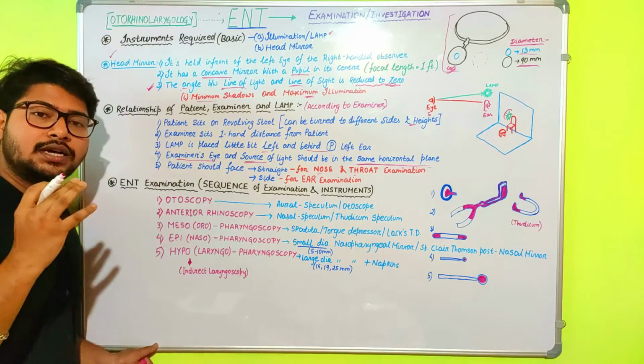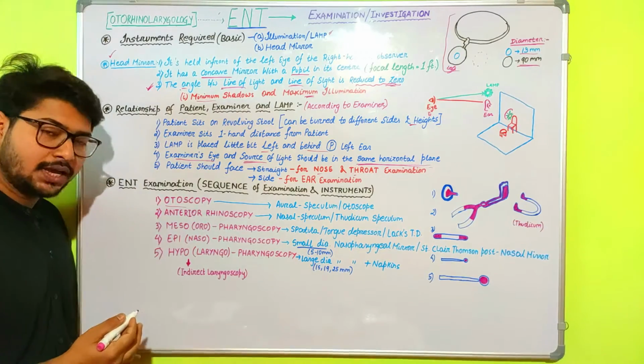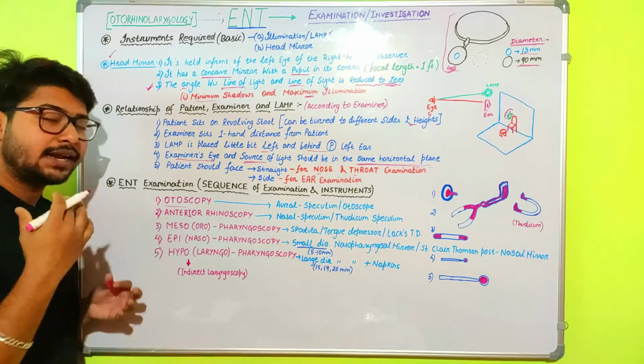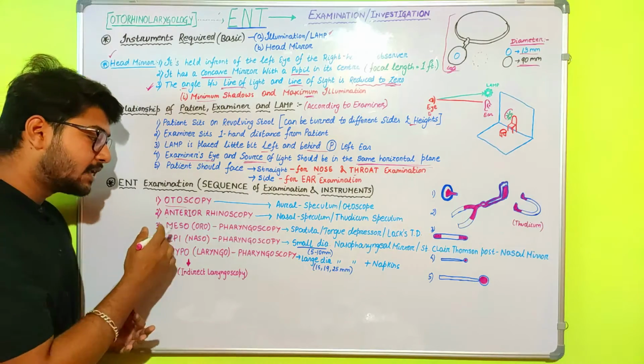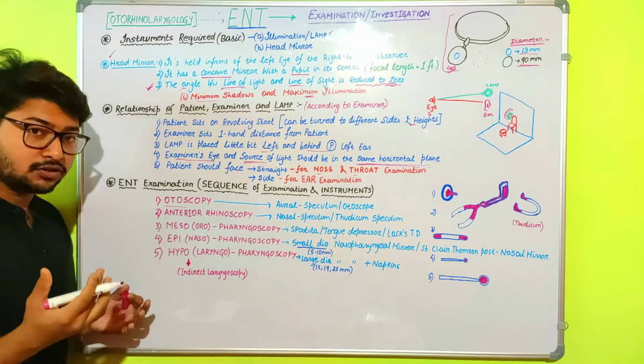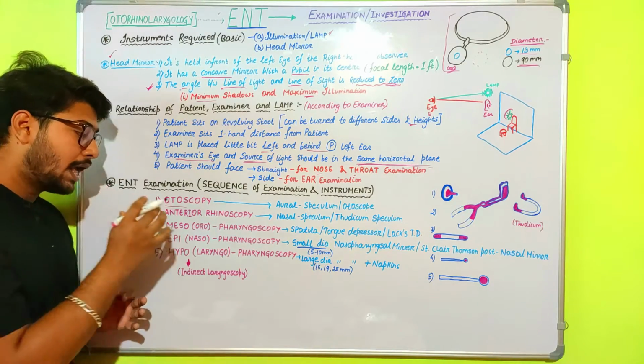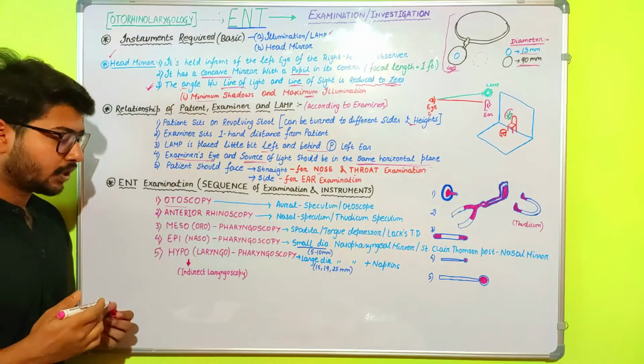First of all, the doctor should follow otoscopy, then anterior rhinoscopy, then meso or oropharyngoscopy, then epi or nasopharyngoscopy, and finally hypo or laryngopharyngoscopy.